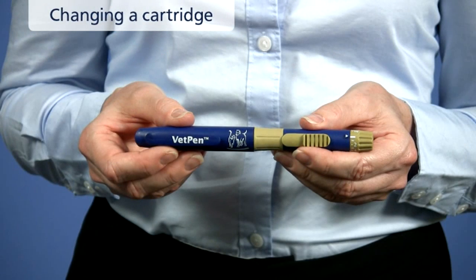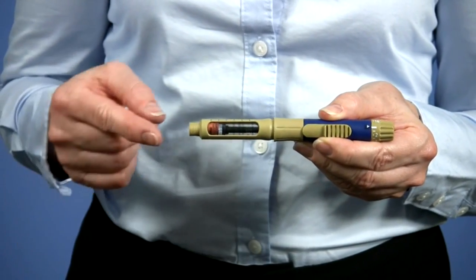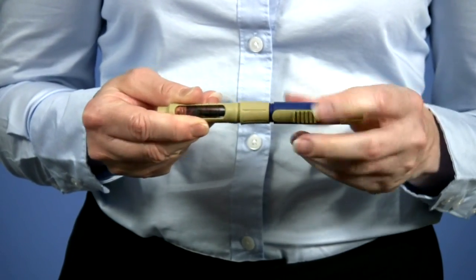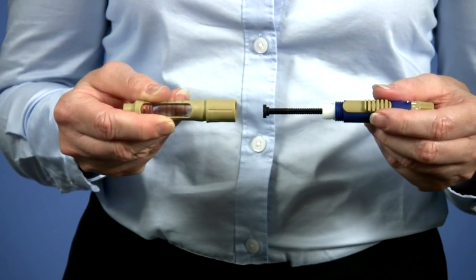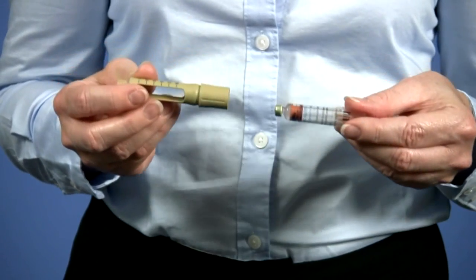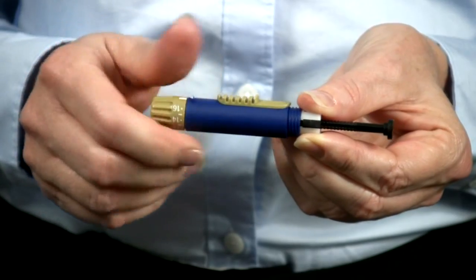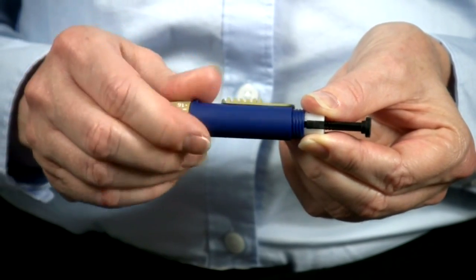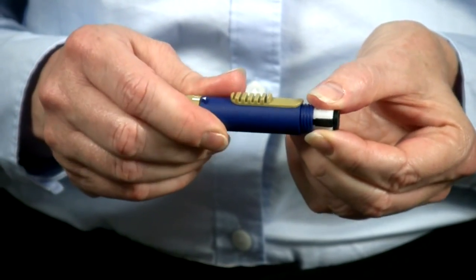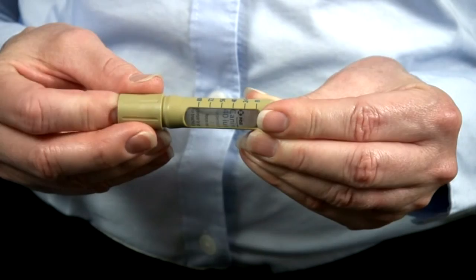Now you will learn how to change the insulin cartridge. Before changing the cartridge, always make sure that the pen needle has been removed to prevent accidental injury. Then, unscrew the cartridge holder from the VetPen body and remove the cartridge. Rewind the internal plunger by holding the white lower part of the pen body between your thumb and finger. Gently turn the VetPen body clockwise until the internal plunger is fully retracted. You are now ready to load a new cartridge as shown previously.